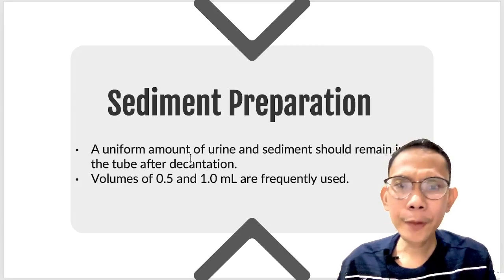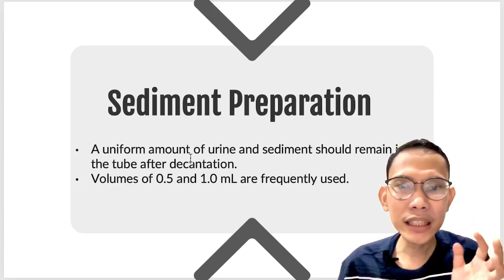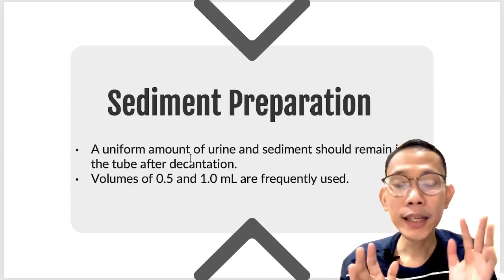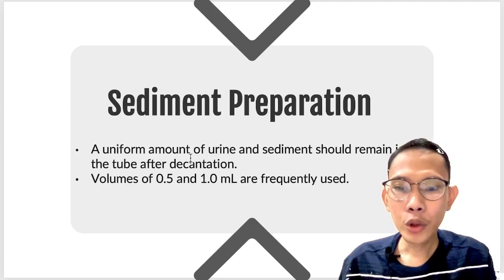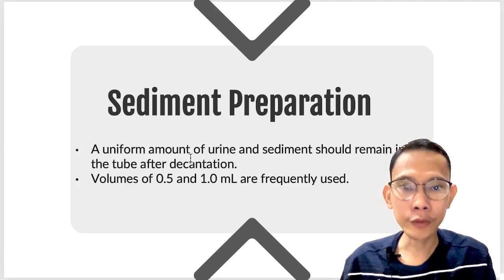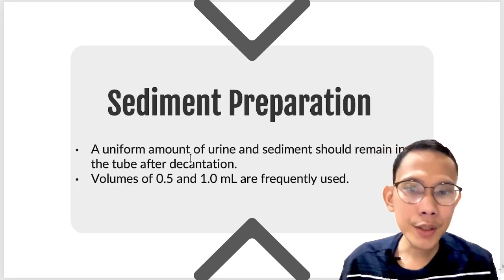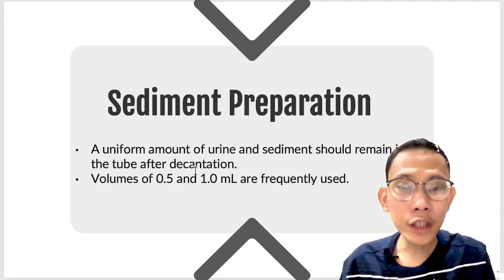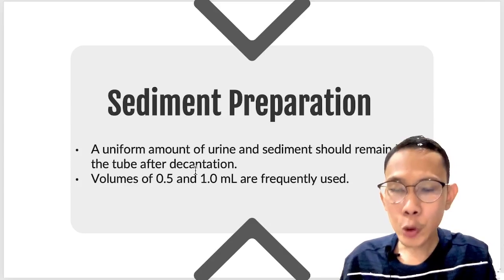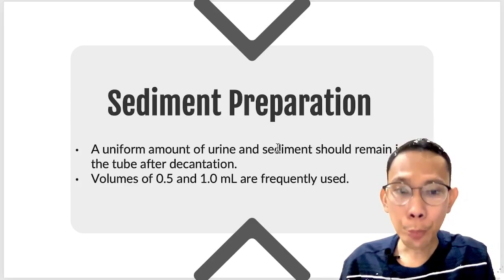Okay? But however, what is being reported or the ideal setup talaga is meron silang ginagamit na commercial system. Sige lang, i-discuss ko lang tong commercial system na to. Kasi sa commercial system, yung supernatant is being aspirated off rather than poured off. Di ba? Usually, pinupour lang namin. Pero, there is a commercial system that to maintain the uniform urinary sediment, the supernatant should be aspirated off rather than being poured off.